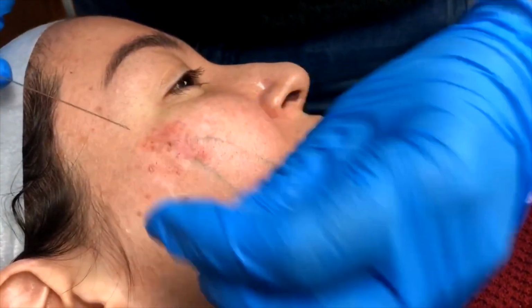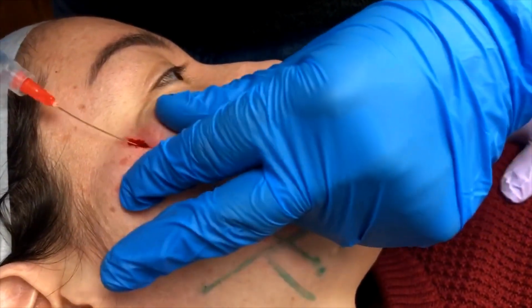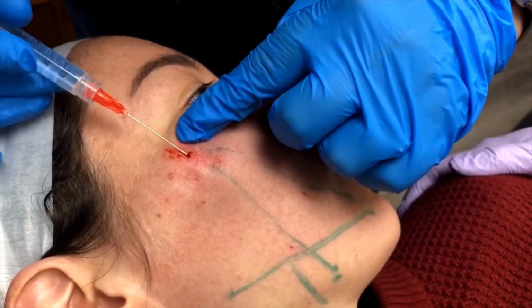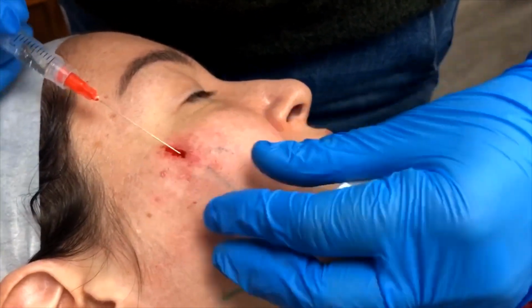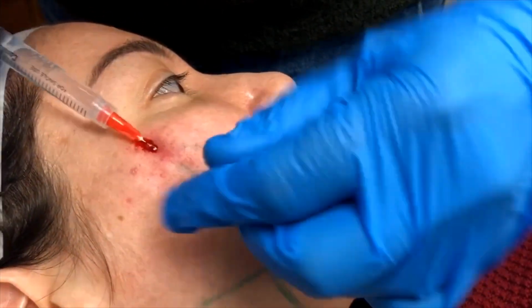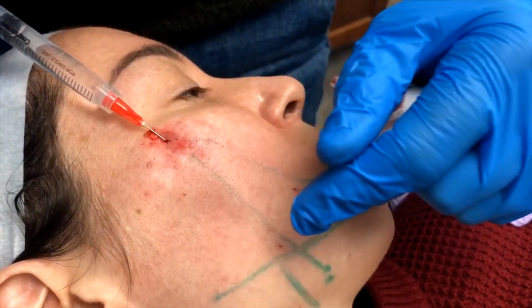And so that is one tunnel for the one thread, and now we are going to go ahead and pre-tunnel this for the second thread. And same kind of a thing. And what you use is what we call the curtain over the curtain rod technique to pull the tissue over the microcannula and not shove the microcannula through. This is the way to use it. Now here's the trick. You've got to use the right microcannula, and only the ComfortDocs microcannula is stiff enough and has the right flexibility that won't dive on you, which is why so many of you hate it.